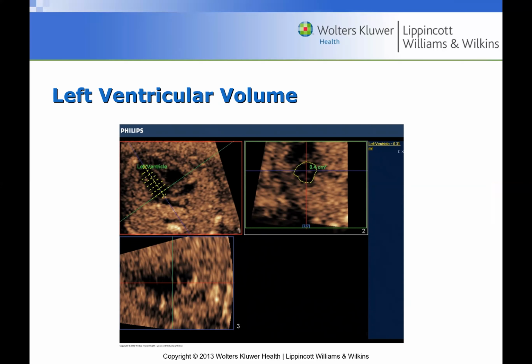You can also do left ventricular volumes when you're doing 3D. Now, at our facility, we don't do 3D, but I know sometimes at the higher centers, they might if they're looking for a specific kind of anomaly.